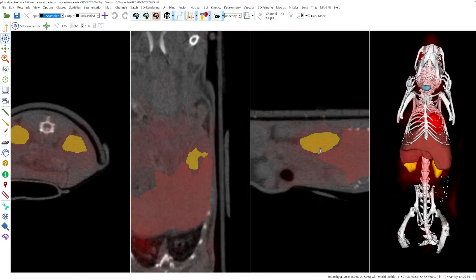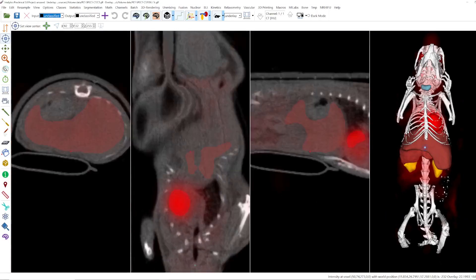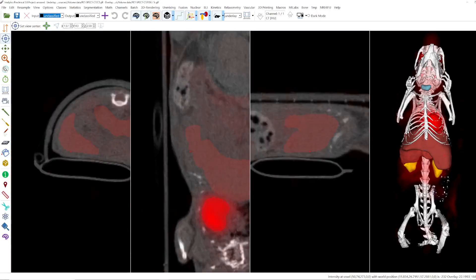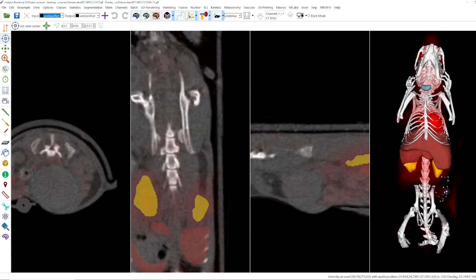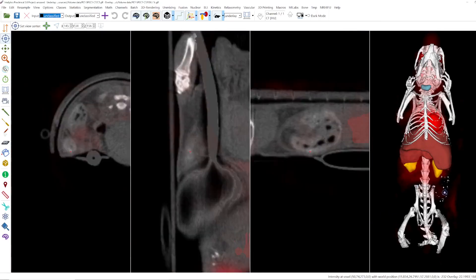This is a very useful function to quickly navigate around and find a suitable slice view for your analysis. But it's important to know: if you click into black, it won't work. You have to click on a segmentation or a white point, for example here on the skeleton or here.